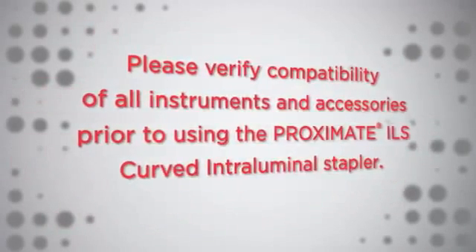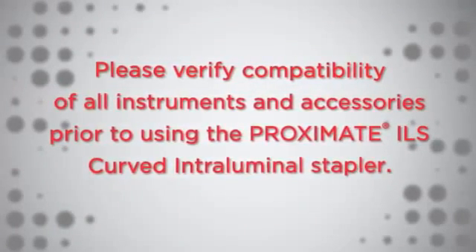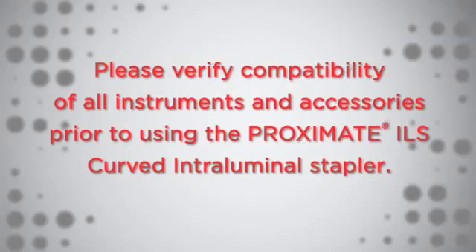Please verify compatibility of all instruments and accessories prior to using the Proximate ILS Curved Intraluminal Stapler.